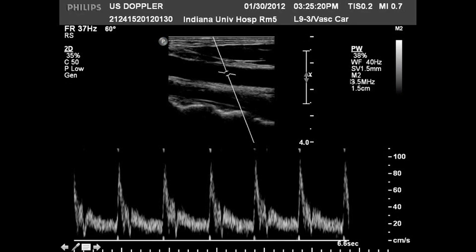When we look at spectral Doppler imaging, instead of having the box we have this line here, which is the beam line — the line that the ultrasound transducer is sending out the Doppler interrogation beam in. It's only listening for echoes coming back around this sample gate. You can see here that the technologist placed the sample gate right in the middle of the carotid artery.